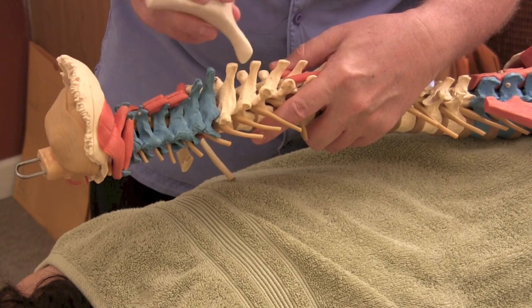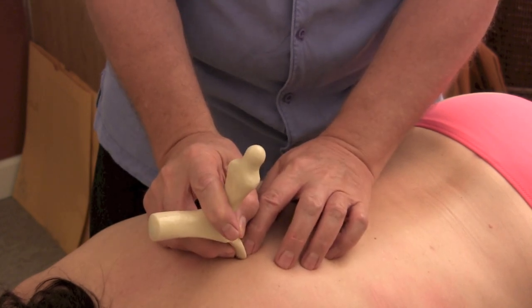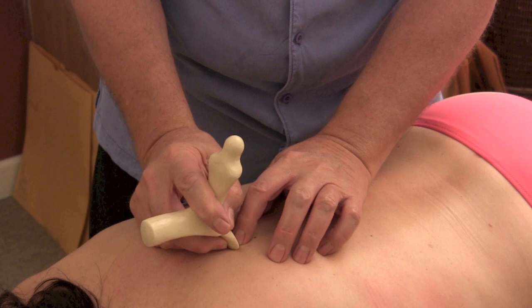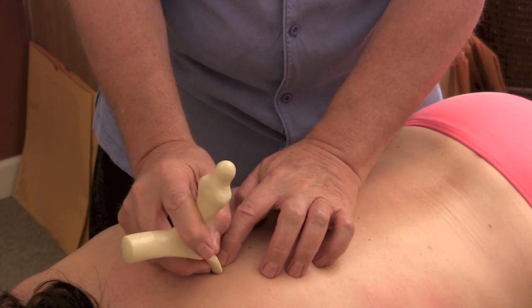There are little muscles, little ligaments, little tendons. You can see I can go right in between the vertebrae, and you want to work through each and every one of these little areas on some people. I can go up one and feel right through the tool — there's the area right there.